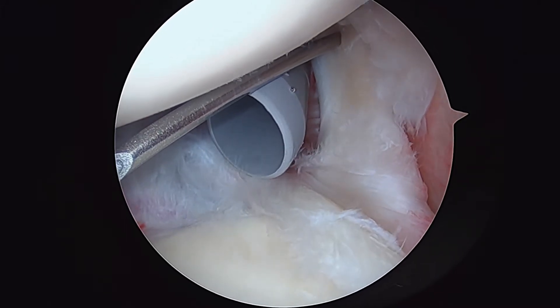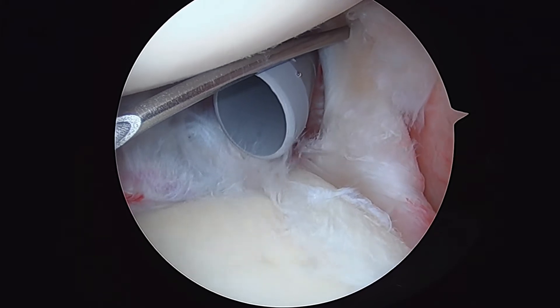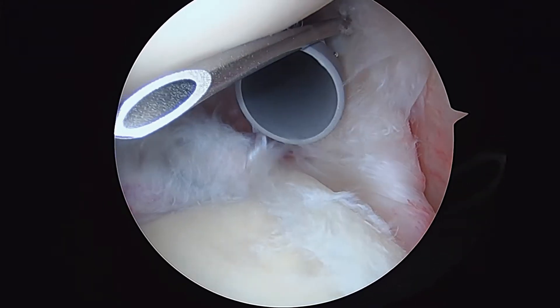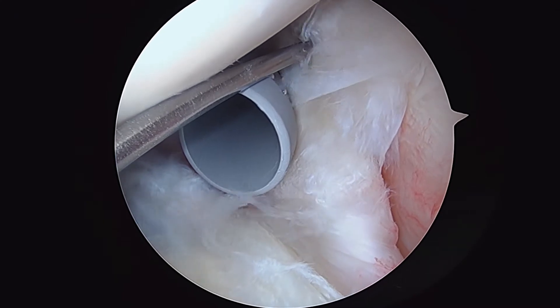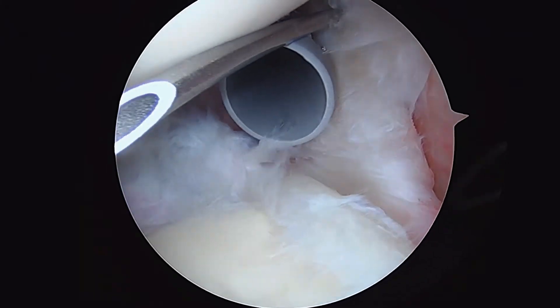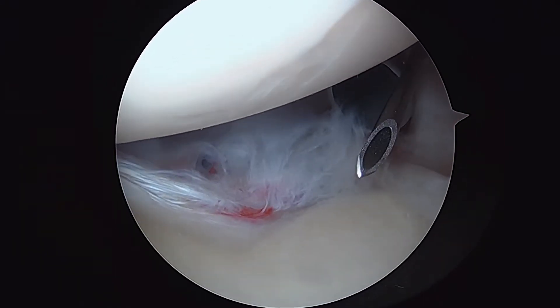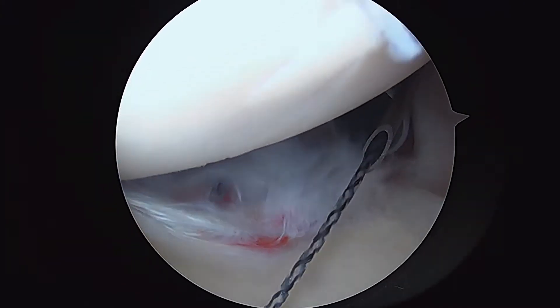Grasper to Vern, and I need the relay. Now what you'll see in a second as you look, there will be a black wire coming through. There it is. That's called a super shuttle.